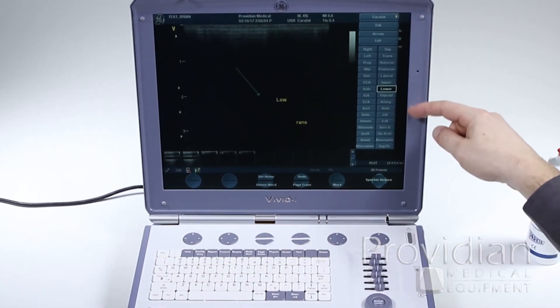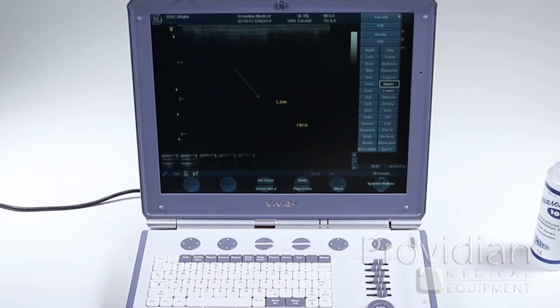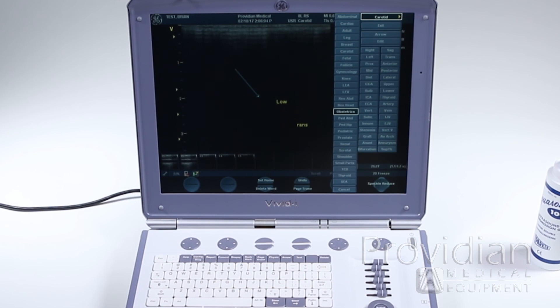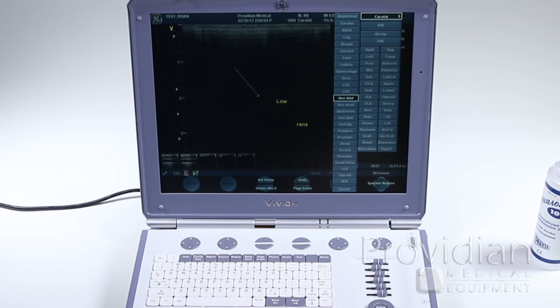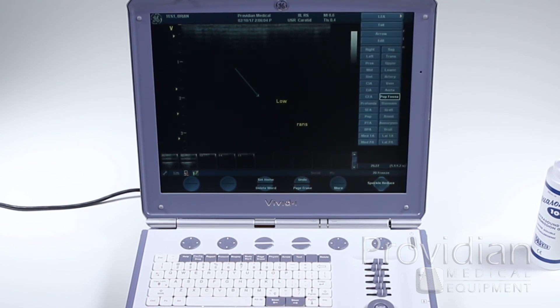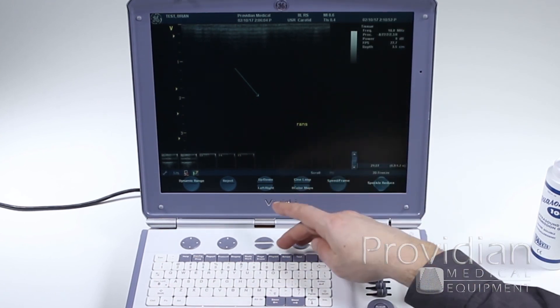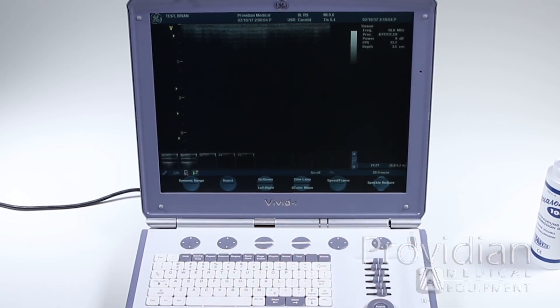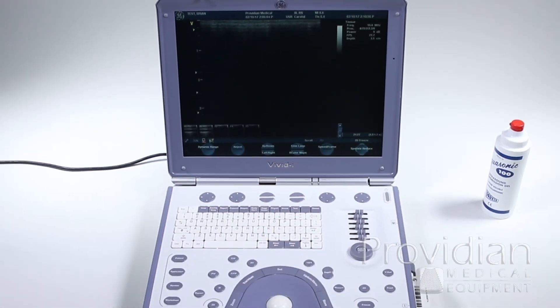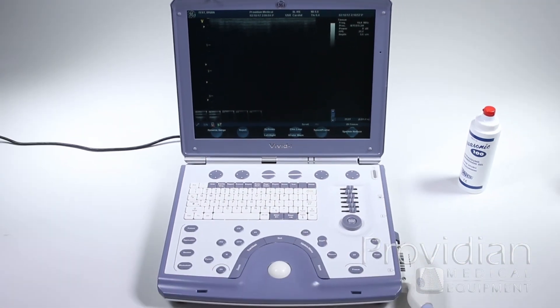We'll get into system setup where this library can be customized and you can choose other libraries. It goes very deep — you can customize each one. For example, I'm on the carotid, but if you're doing lower extremity artery, there are very specific annotations for that as well. You can delete to remove the last annotation or page erase to remove all annotations. Next, we'll get into reports and exporting.